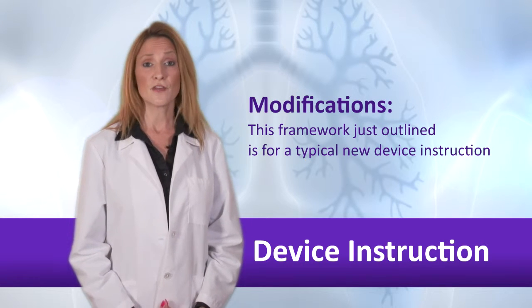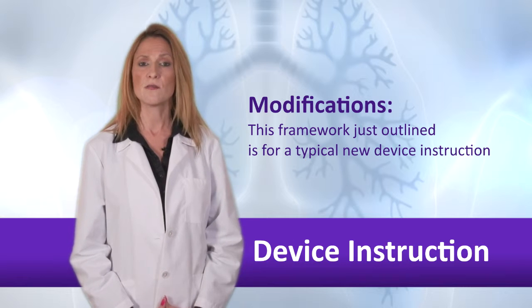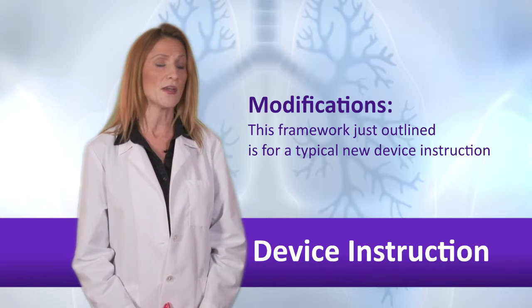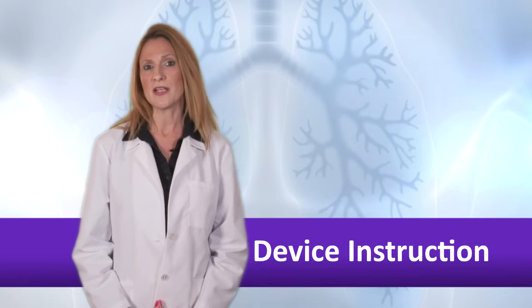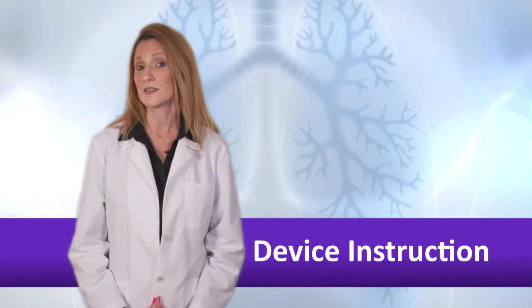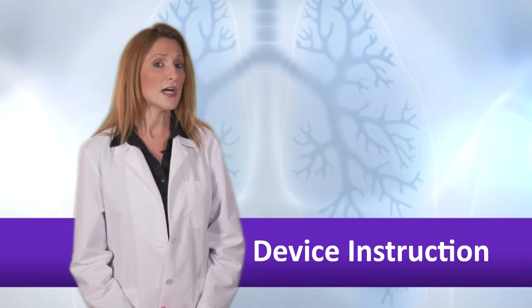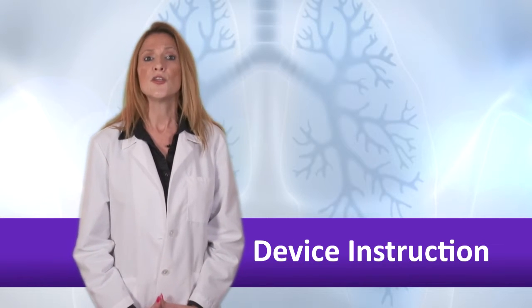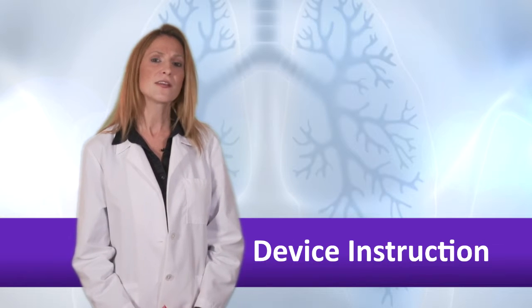Modifications. This framework just outlined is for typical new device instruction. It assumes that there's little or no prior knowledge by the patient. Some modifications of this framework would be appropriate based on the patient's prior knowledge and skills. If the patient has used the device before, or this is a follow-up from a previous visit, you might, after the introduction, go right to the show me portion of the session.